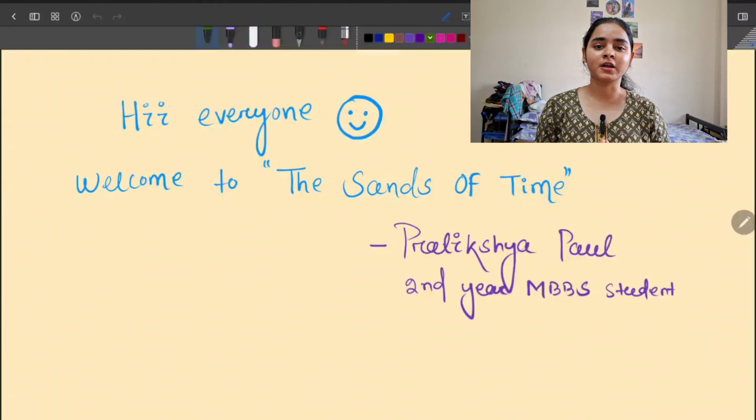Now that all of you know the thumb rules of histology, let's get into the basics of histology. That is, today we are going to read about the epithelia, the muscular tissue, and about the cartilages.